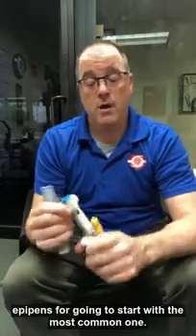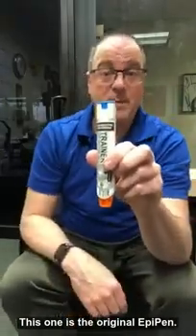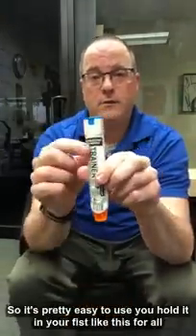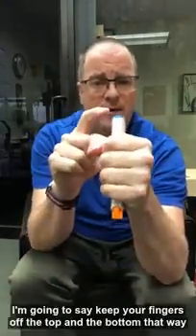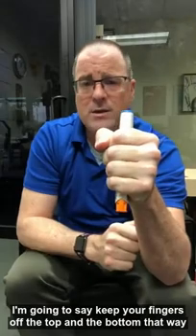We're going to start with the most common one. This one is the original Epipen. So it's pretty easy to use. You hold it in your fist like this. For all the Epipens, I'm going to say keep your fingers off the top and the bottom. That way you can't screw it up.